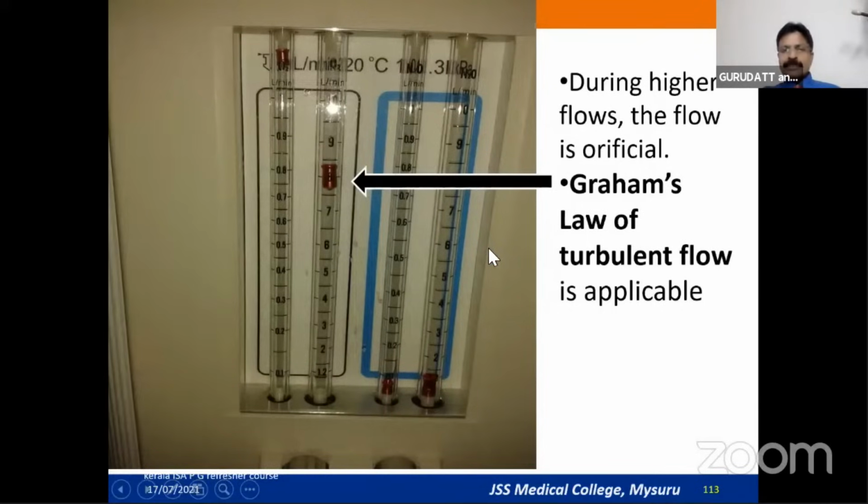And the problem here is the nitrous oxide may go more to the patient when compared to oxygen, and actually you may be giving a hypoxic mixture to the patient. That is why if you want to use it at a higher or any particular change in the altitude, you have to have these flow meters calibrated to that particular altitude.